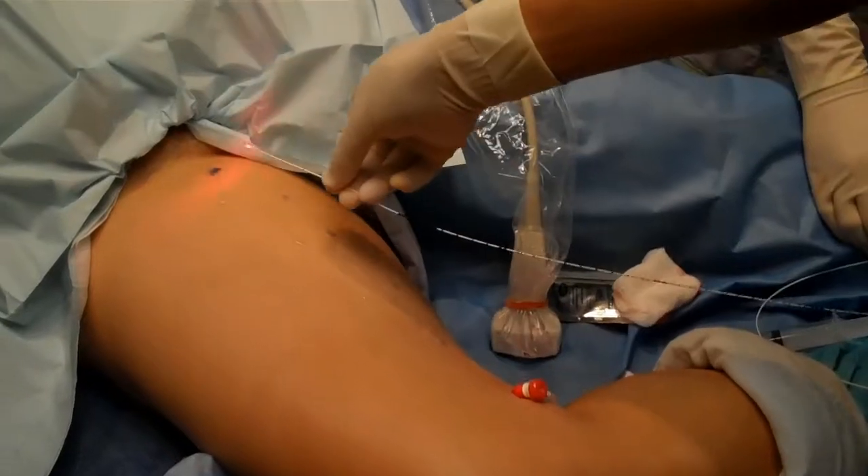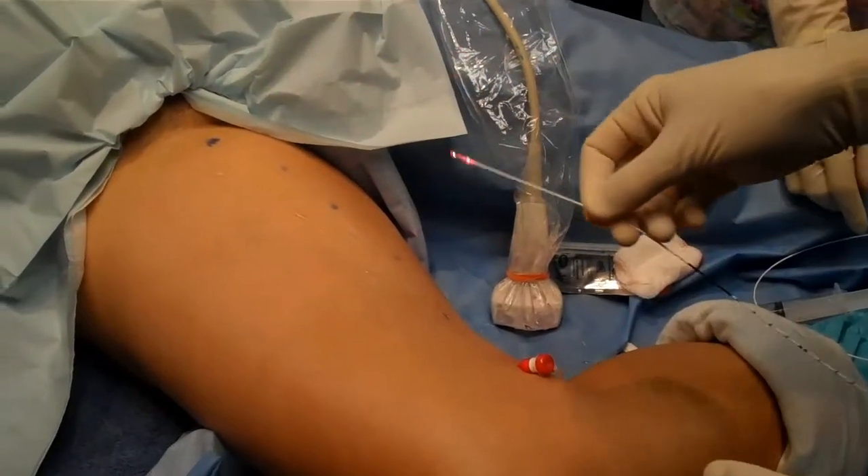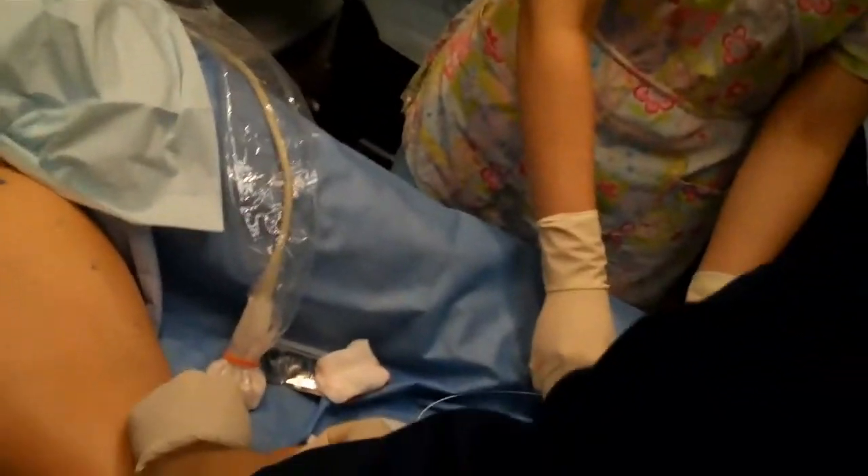It will be placed in your vein just under the main bad valve up there by your groin. We're going to slide it up — turn off the lower light here. You can see that glowing light; that's the tip of the laser fiber going up there.